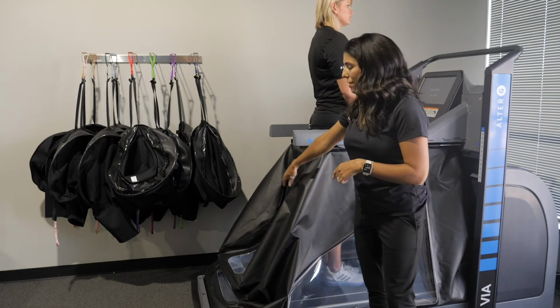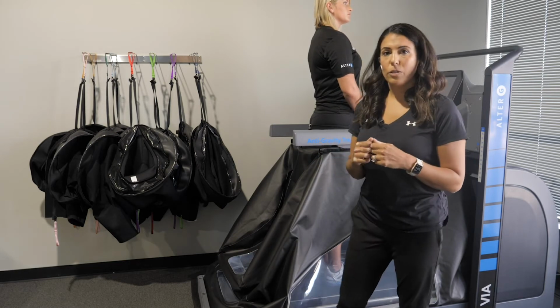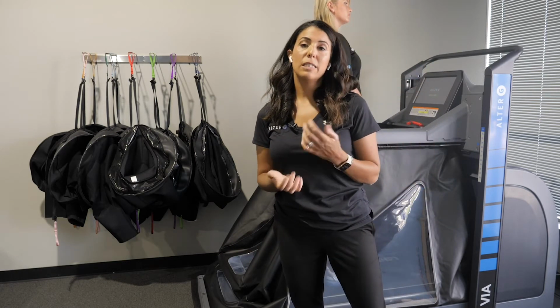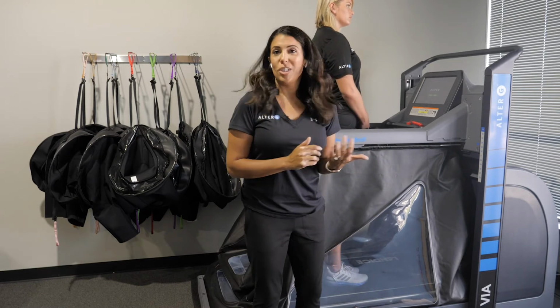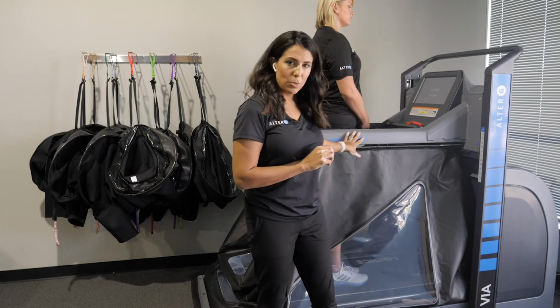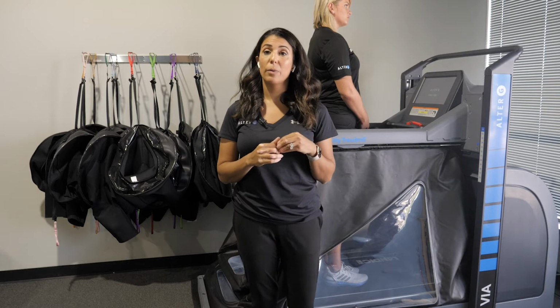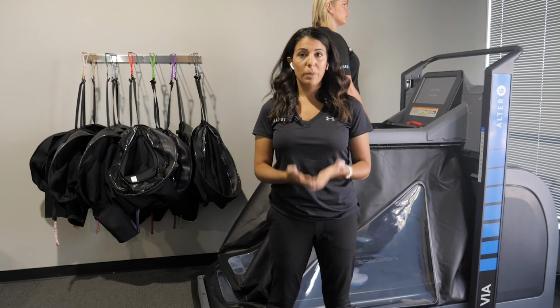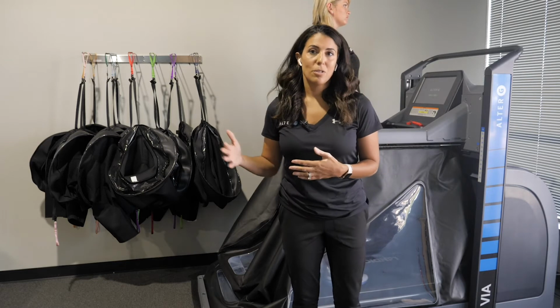So the pressure inside of the bag is going to be greater than the pressure outside of it, and then we're going to be able to control that amount of pressure to dictate how much body weight support we want to provide. The AlterG is the only body weight system that accurately measures each user each time they actually use the treadmill. So then we know when we're calibrating, it's precise to your patient's weight, your patient's height, and it's going to be consistent every single session.